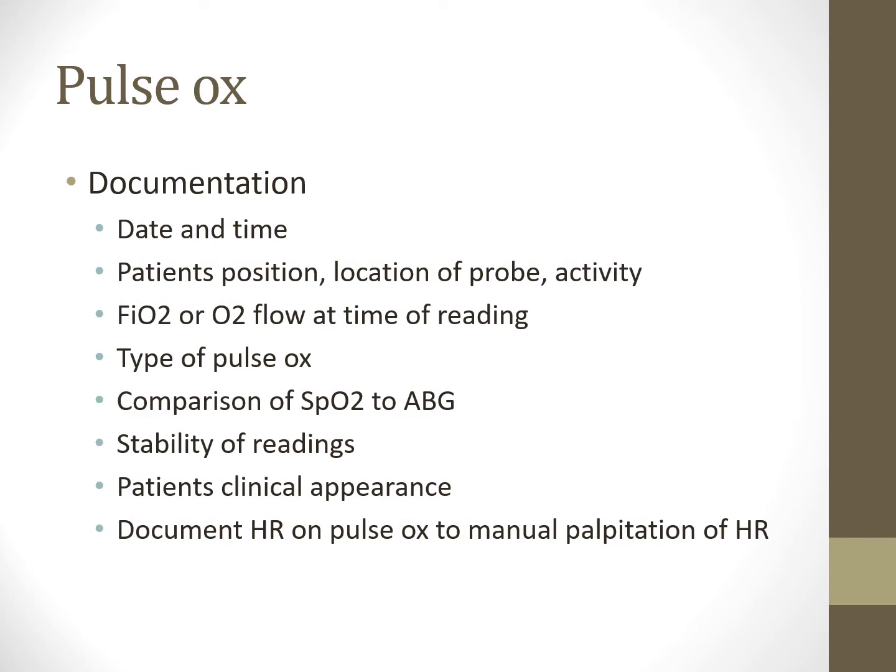Documentation, of course. If we're doing pulse ox checks or a 6-minute walk test or anything like that, we have to document the pulse oximetry. Obviously, date and time, what position, were they walking, where was it, were they active, were they ambulating, or were they resting, right? How much oxygen were they on, what type of pulse ox, does it correlate to the blood gas, how stable is the reading, good waveform, and what was the patient's clinical appearance with it, right?